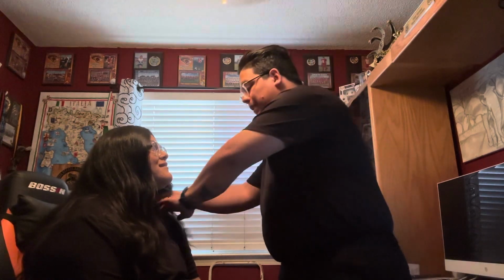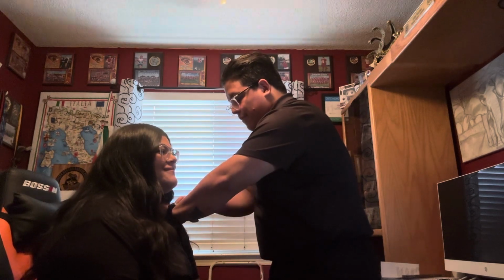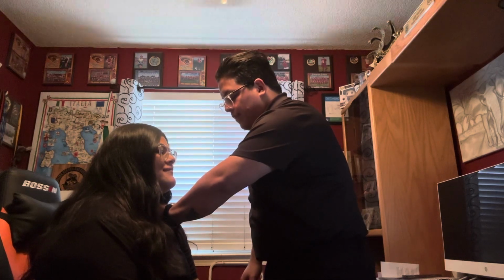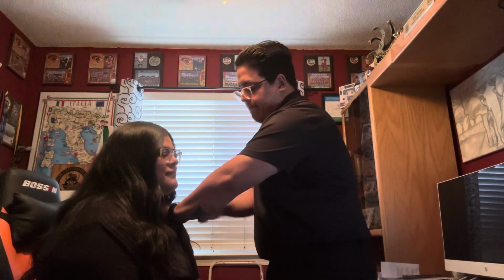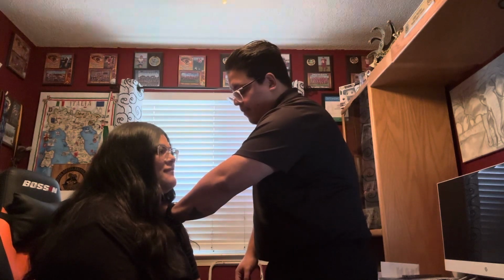The next thing I'm going to do is see how you're breathing. Okay? I'm just going to put my hand on your shoulder, okay? I have a little bit of wheezing. You've been having a little bit of wheezing? I'm asthmatic. Oh, you're asthmatic. Okay. I'll be able to hear that with the stethoscope. Are you having any trouble breathing right now? Mm-mm. Okay, good.